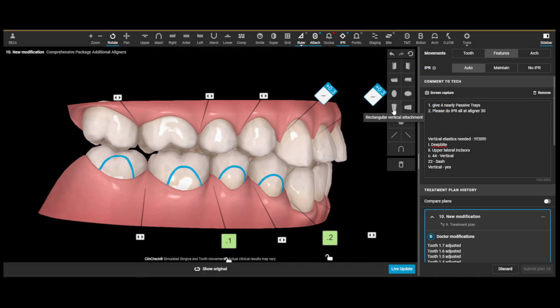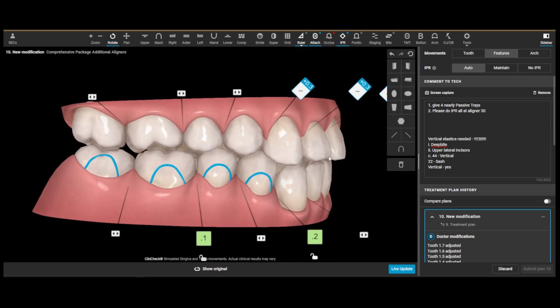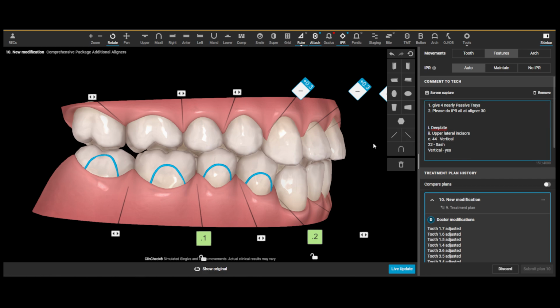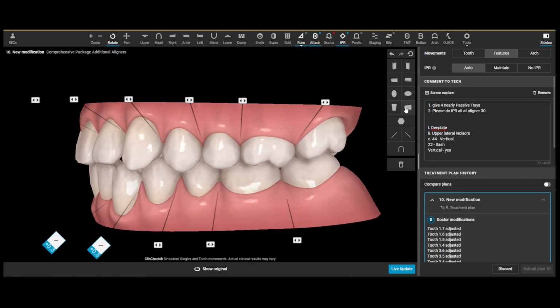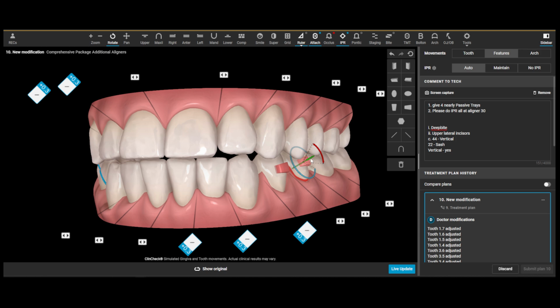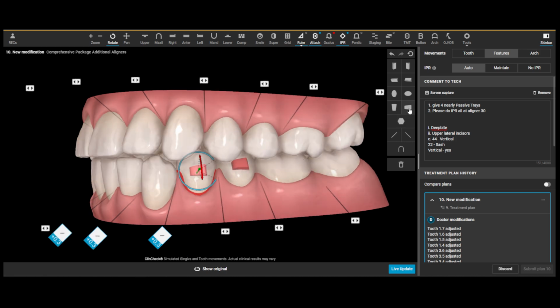And now I have button cutouts to hook on my elastics. So that's my vertical elastics. I need attachments changed on my lower premolars. So the attachments we like to use are nice, thick, horizontal, 3 to 4 millimeter rectangle attachments. Grab them, pull them to their maximum thickness, easy peasy.